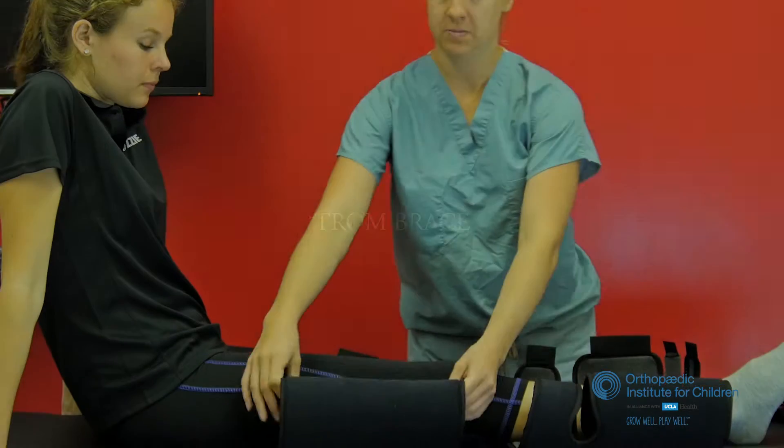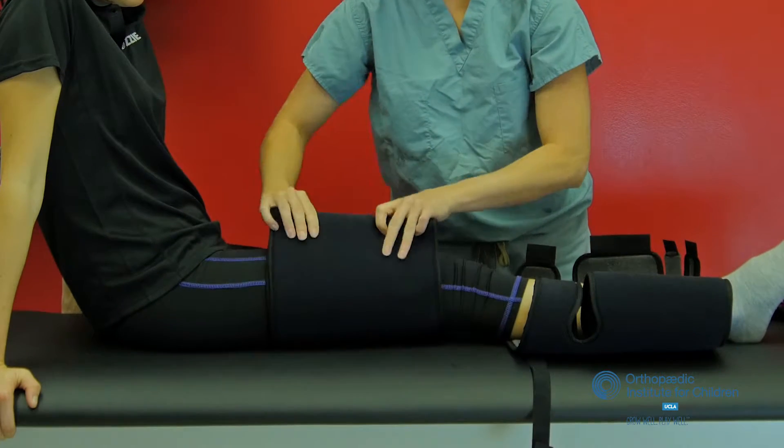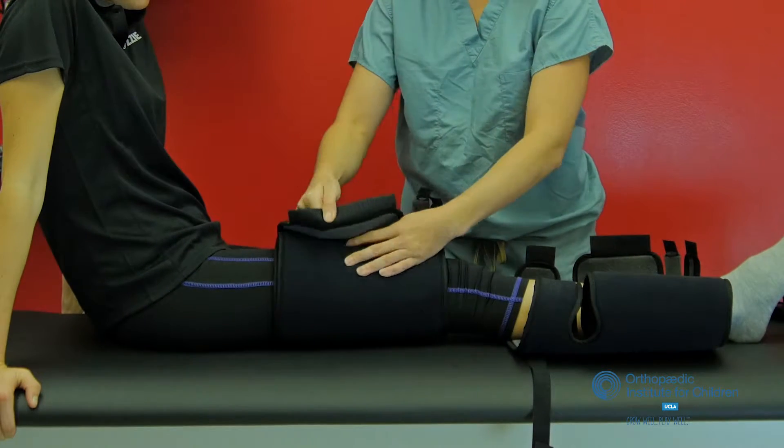Basic instructions for a T-ROM brace. This brace should be applied in the operating room before you leave the hospital.